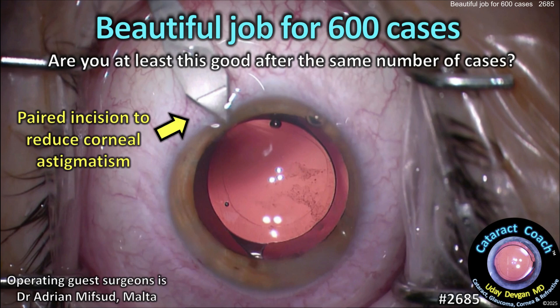cataractcoach.com. Beautiful job for 600 cases. Are you at least this good after the same number of cases? Let's watch a complete case here.